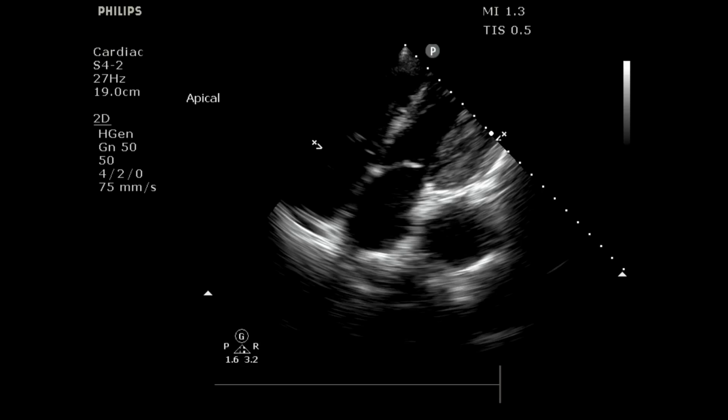In fact, if you look to the left of that center chamber, that is the right atrium. So we have this extra thing just off to the side of the left atrium. Thinking back on anatomy, the thing that should be there is the descending thoracic aorta. So this is a very, very large descending thoracic aorta. Even though I don't have calipers on this right now, you can definitely see that it approximates the size of the left atrium, which is certainly not a small chamber by a stretch of the imagination. So this is definitely greater than the 4 centimeters in diameter that we would be expecting in at least the aortic root, although at this point it probably should be a lot smaller than 4 centimeters.